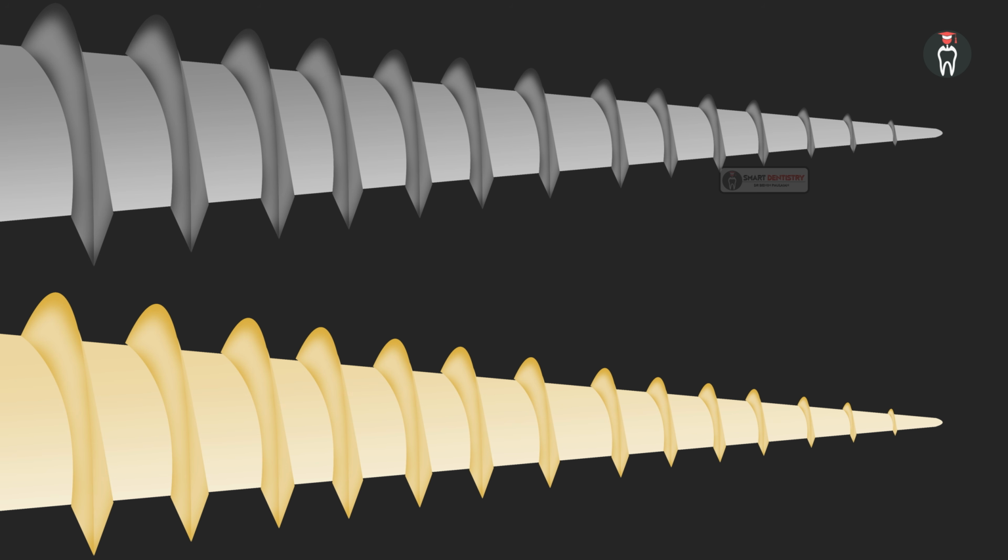Those files have more tendency for screw-in compared to the controlled memory files, because these controlled memory files are more flexible, and these flexible files have less tendency for screw-in compared to the rigid files, like the older austenitic forms. So it is better to choose a file which has a controlled memory type of alloy.